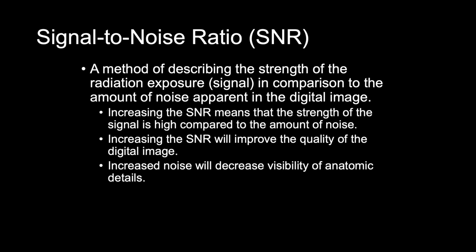SNR is a method of describing the strength of the radiation exposure or the signal in comparison to the amount of noise apparent in the digital image. Increasing the SNR means that the strength of the signal is high compared to that amount of noise. Increasing the SNR will improve the quality of the digital image.